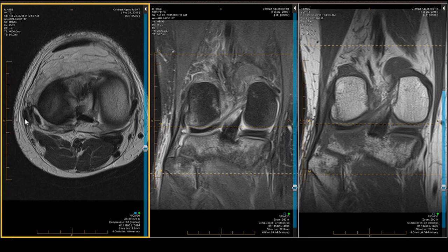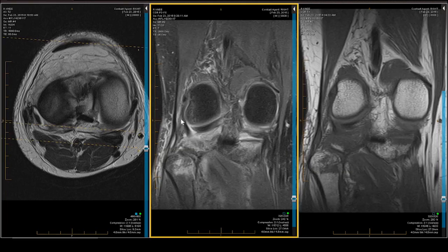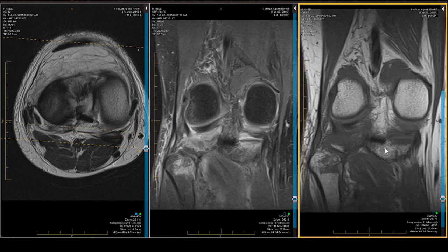In the coronal projection we have: popliteus, fibular collateral ligament, and then biceps femoris — one, two, three. Because this patient had a twist as opposed to a varus or valgus injury, we have to be worried about the corners. That also explains why there is a fibular head comminuted fracture, which tells us more about the mechanism of injury and heightens our concern about the corners.